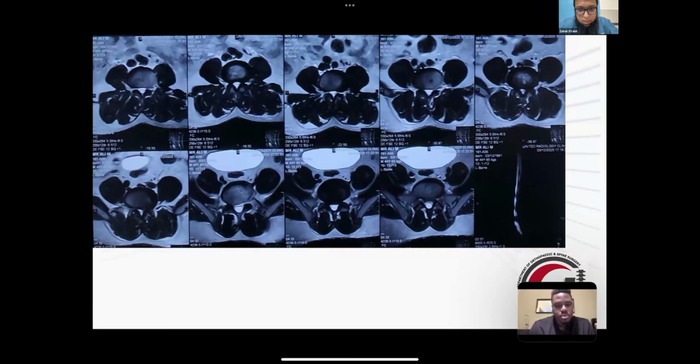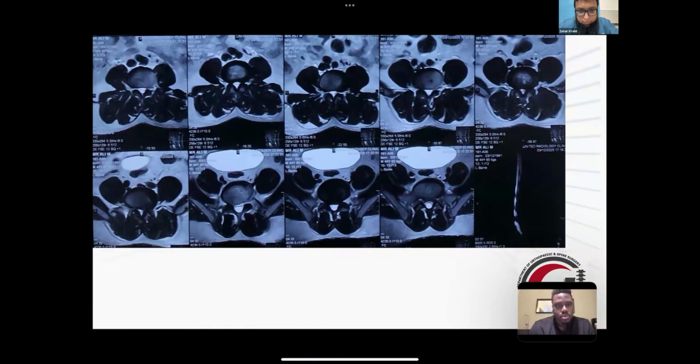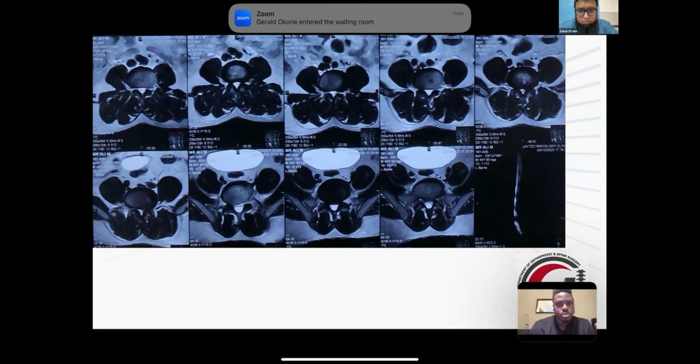With the biportal endoscopic technique, there is great freedom of movement of both hands, the working channel and the viewing portal. As the patient has more symptoms on the right side, I decided to go from the left side. With this interlaminar approach of UBE, we can decompress the right-side foramen very well from the left side, as compared to uniportal endoscopic techniques.